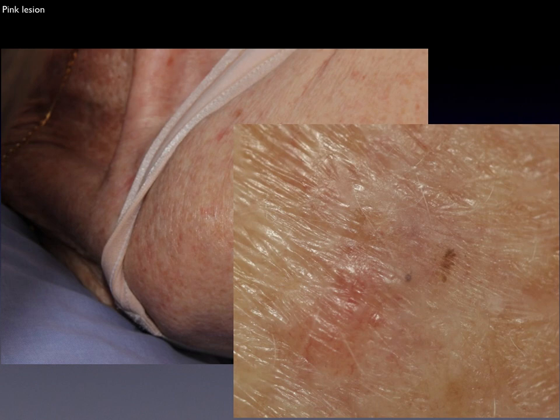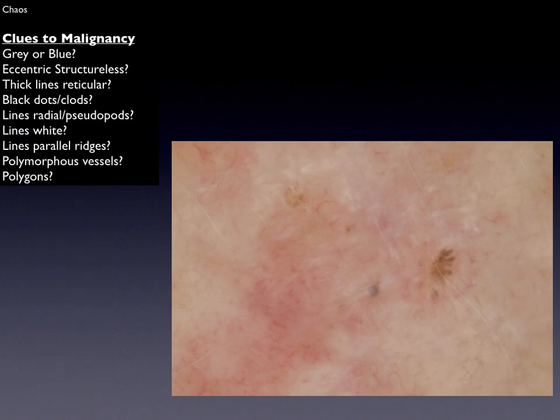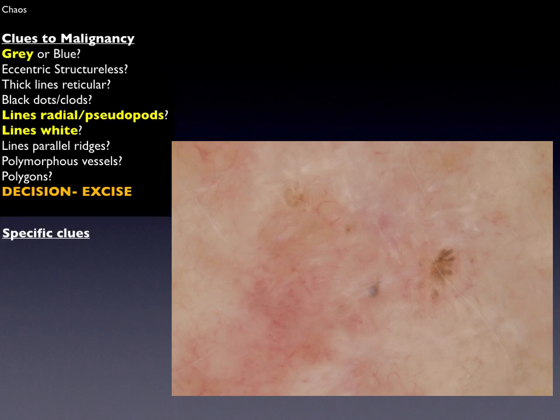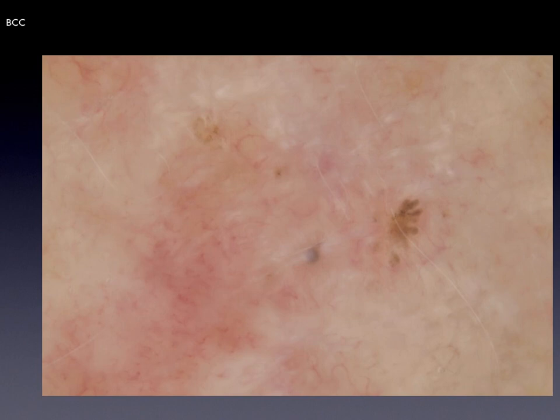This subtle lesion on the shoulder is pink, and we cannot recognize it as one of the five common benign lesions, so we apply pattern analysis — in this case chaos and clues. It is asymmetrical, and we can see clues to malignancy of gray and blue, as well as lines radial segmental and polarizing-specific white lines at right angles to each other but not crossing. We make the decision to excise. Then we look for specific clues: absent lines reticular and lines radial converging and extending from a hypopigmented area — these point specifically to basal cell carcinoma.